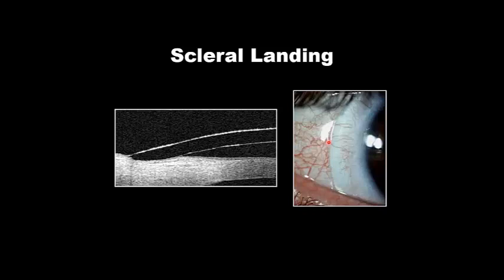This one might be more like -2 because you're seeing greater than 30 degrees of that seal off or that blanching. If it's 30 degrees or less at any number of points, then you might go a scleral landing zone -1. If it's greater than 30 degrees, probably scleral landing zone -2 might be called for.